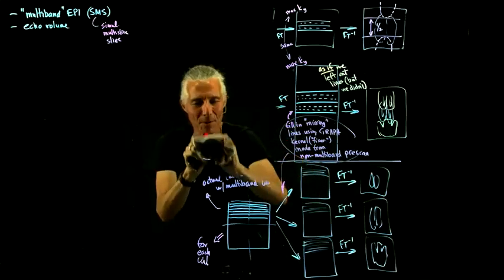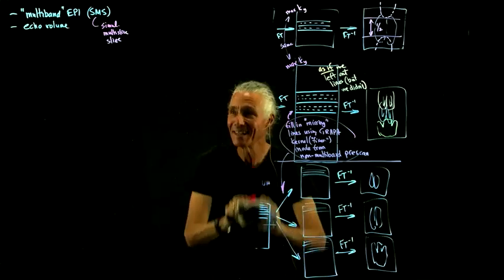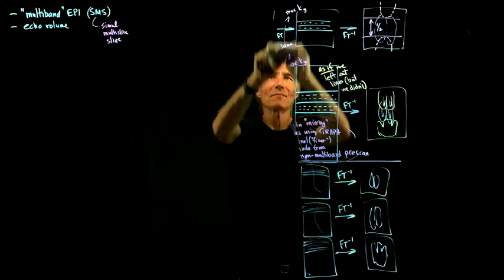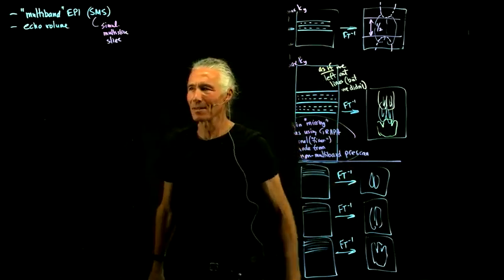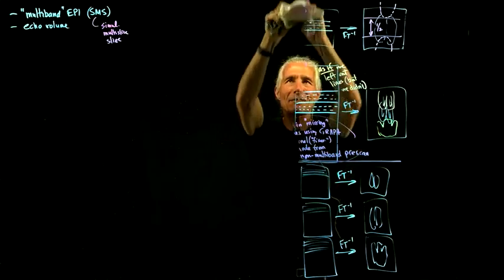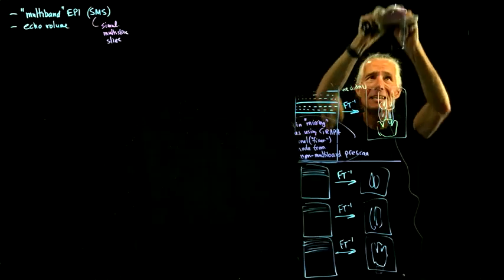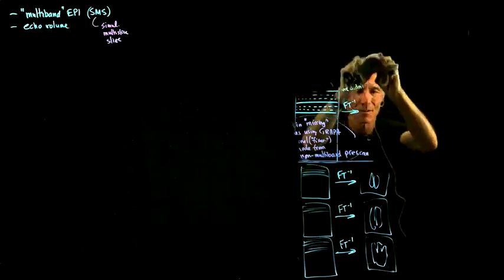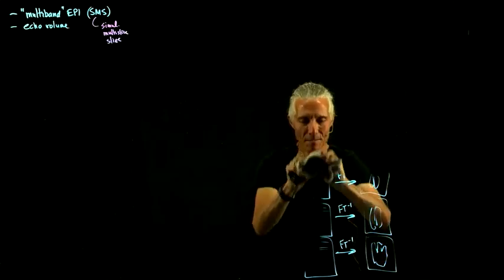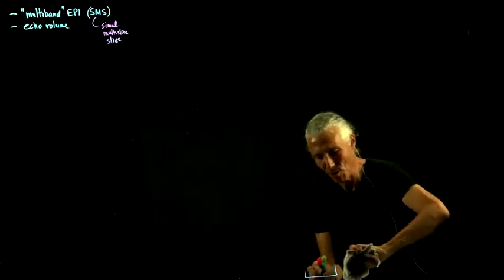So it's important, if you're scanning anybody, to tell them, do not move even before the task starts. Because I've been in the scanner numerous times, and I have the same feeling. I just feel like, well, I don't have to fixate yet because the scan hasn't actually started, but actually it has. So that's another issue with these kinds of scans. You could end up with some bad data that contaminates the whole rest of the scan.